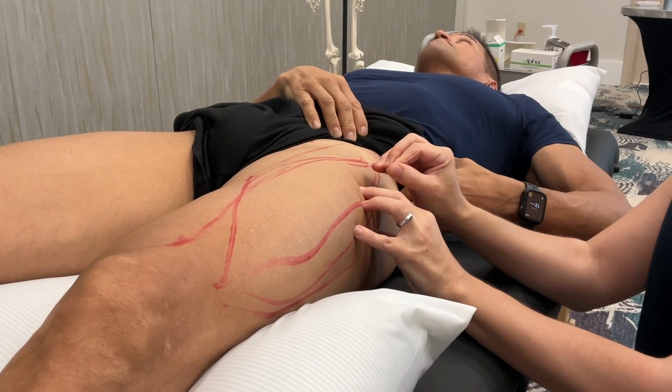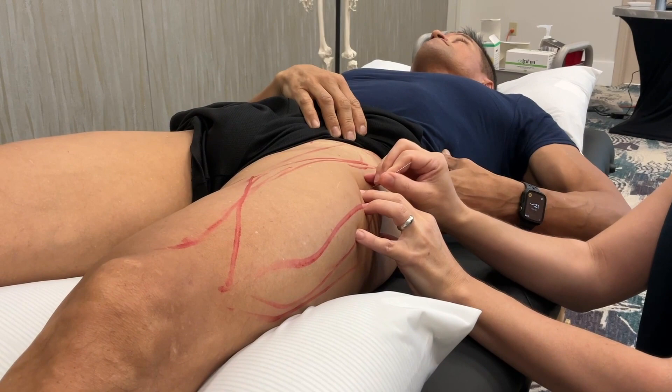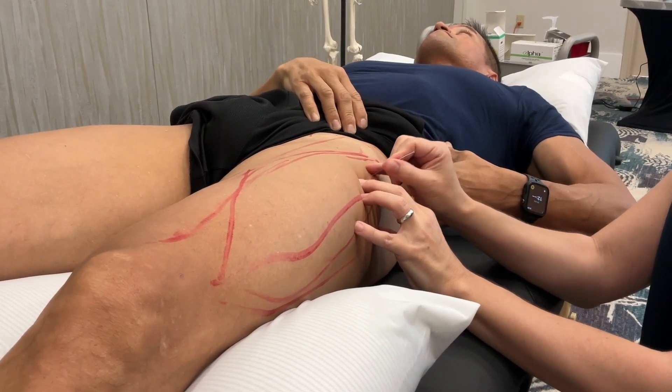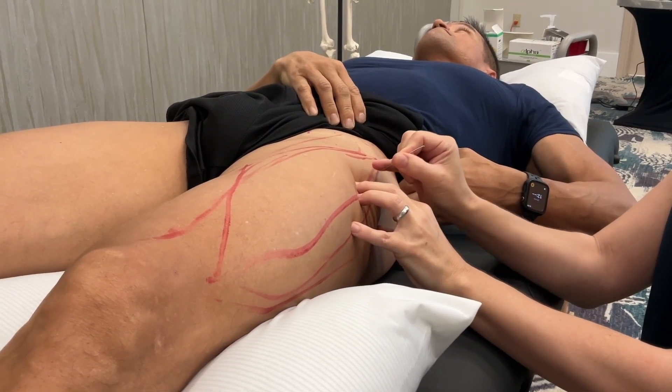I'm just gonna fan a little bit. There's a lot right here at this vector. Are you all seeing that? Still going.